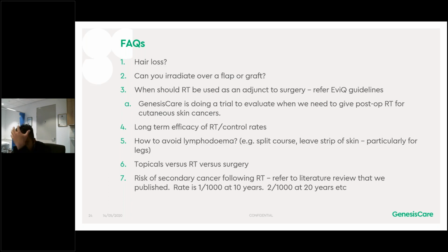And he's got cancer all over his scalp. So I told him, look, I'm going to do my best to actually keep that ponytail for him. And believe it or not, that was still there even after 9 months of radiation. He actually has a similar appearance to those patients I've shown you already, but this ponytail is still there. So we keep that away from the radiation field.